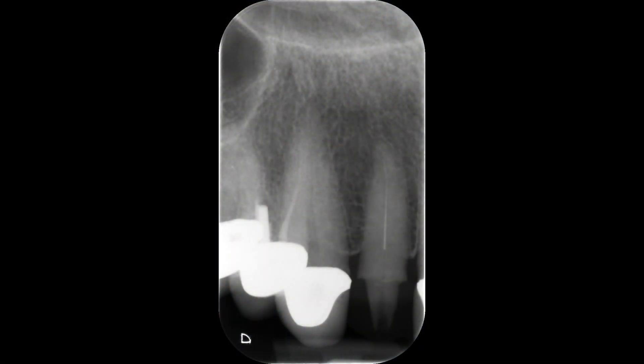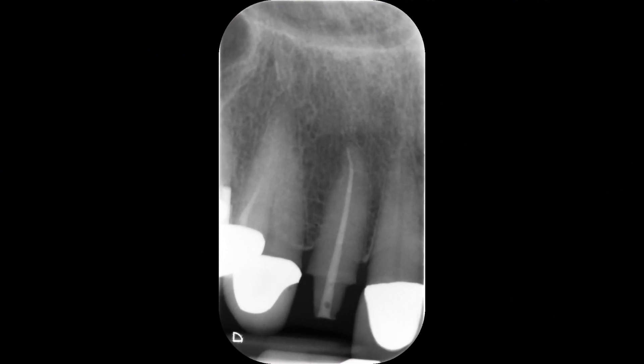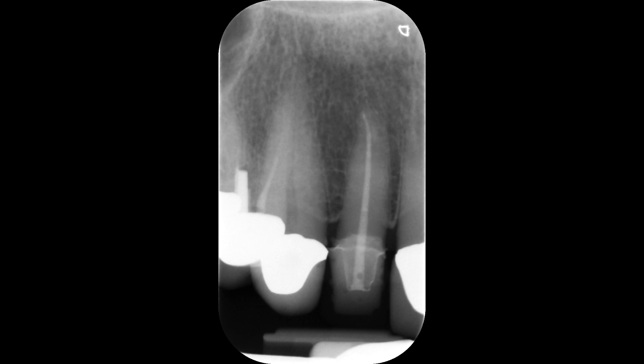So to recap: here we have the preoperative radiograph showing the fractured instrument in the root canal, the tooth prepared for a crown and a small access, the final radiograph showing an excellent coronal apical seal with vertically compacted gutta percha and dual cure composite in the access, and finally a radiograph after cementation of a temporary that was constructed with acrylic.